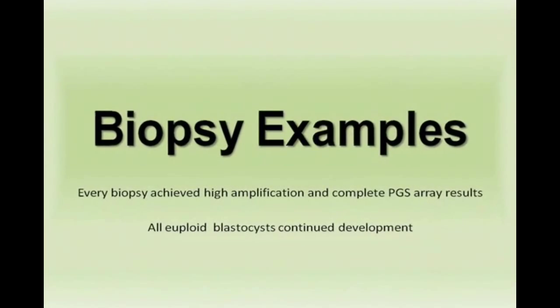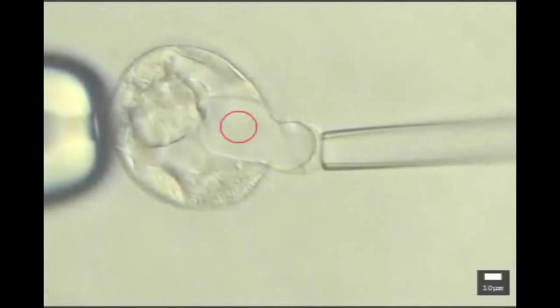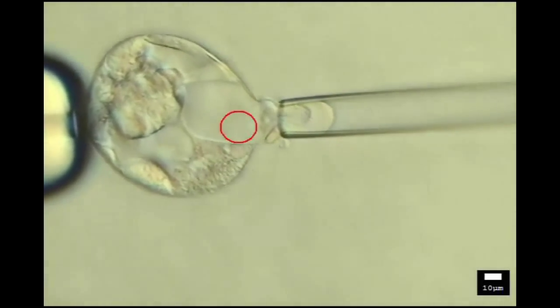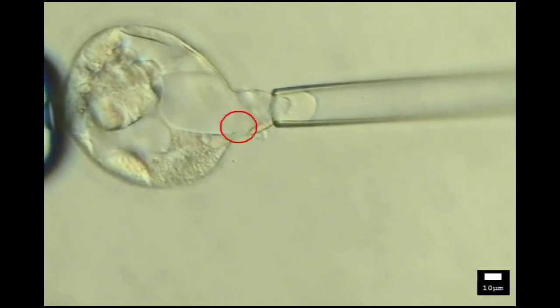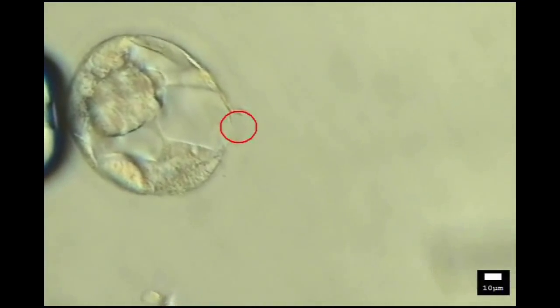Here are some examples of our blastocyst biopsy. We begin with a 3-AB biopsy — this is the earliest blastocyst stage we will biopsy. The trophectoderm is aspirated into the biopsy pipette. Two laser pulses are administered and a small mass of trophectoderm cells results.